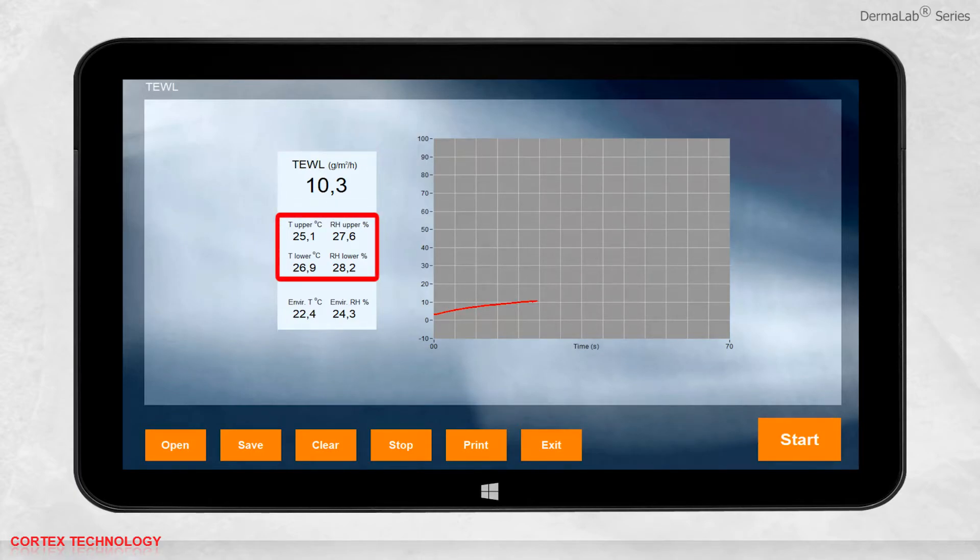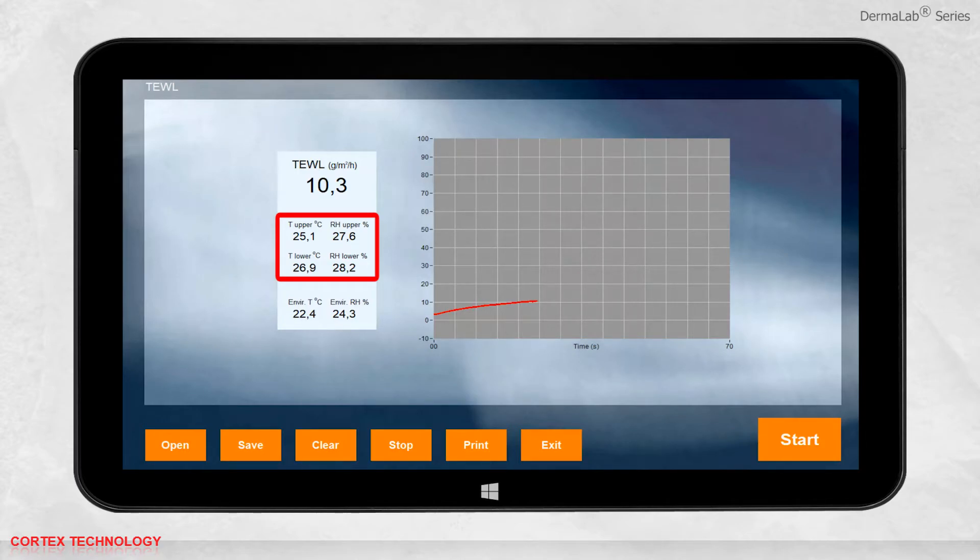The T upper, T lower, RH upper, and RH lower represent the individual sensor values inside the probe chamber.